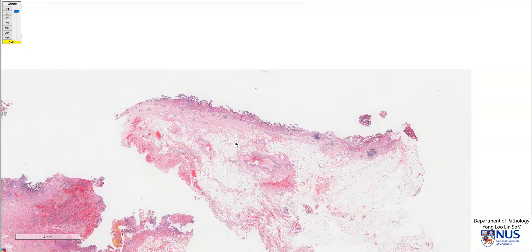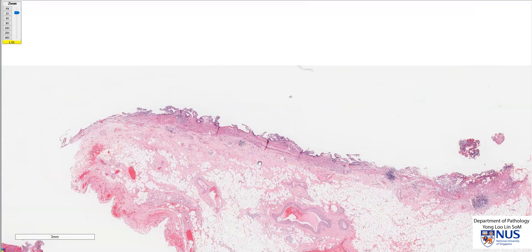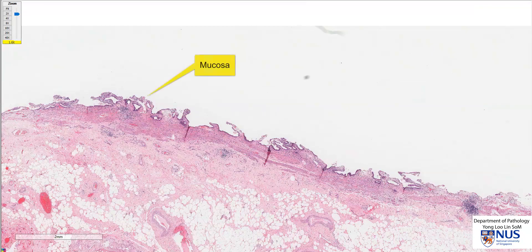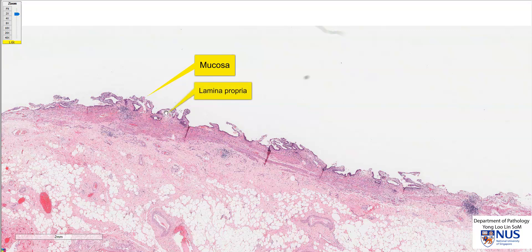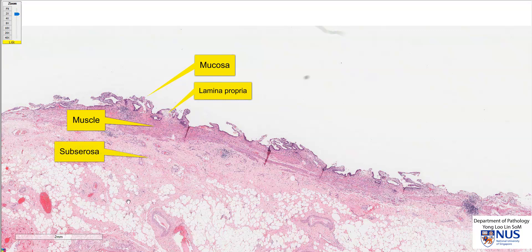Let's start with this piece. We can see that this is the mucosal surface — here is the luminal surface of the gallbladder. We have the layers, which are the mucosa with the lamina propria, the muscle layer, and the subserosa.